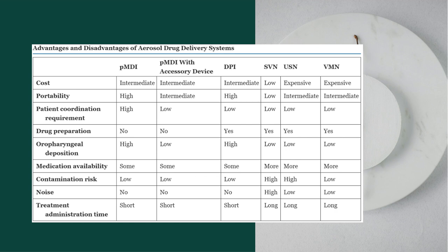and patient adherence. Connecting this to our overall theme, optimizing aerosol therapy means selecting the right nebulizer technology tailored to the patient's condition and lifestyle, ultimately improving therapeutic outcomes.